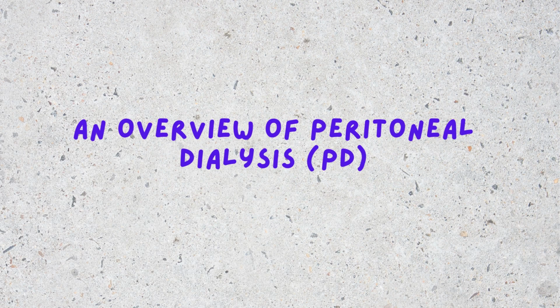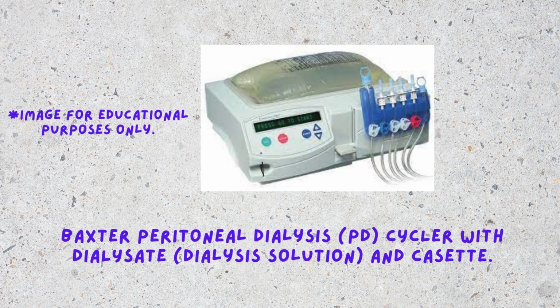An overview of peritoneal dialysis, which is a type of dialysis involving the peritoneum, which is the membrane around the abdomen, and the use of dialysis fluid. It doesn't involve the use of blood.